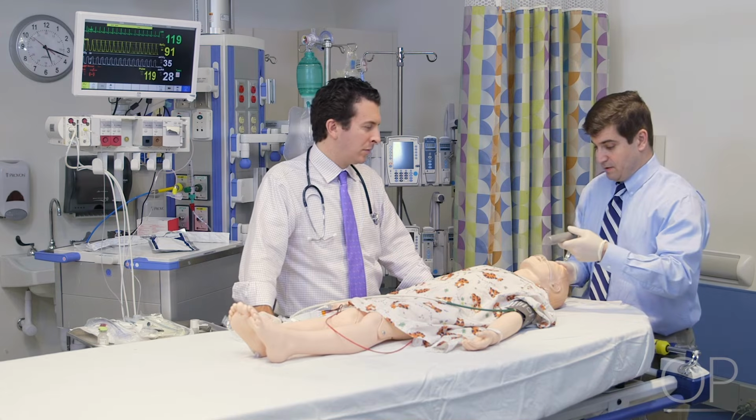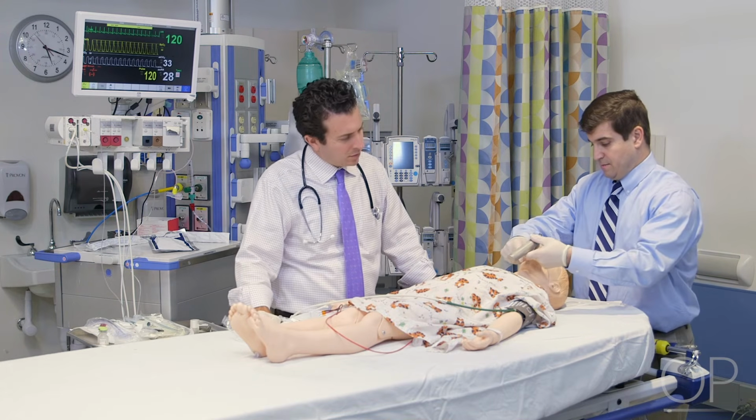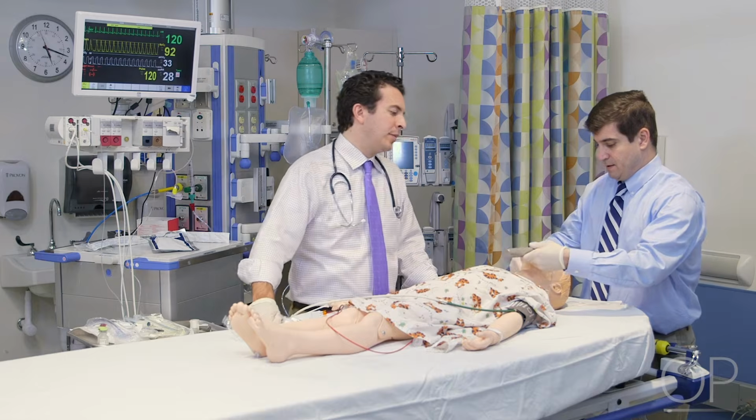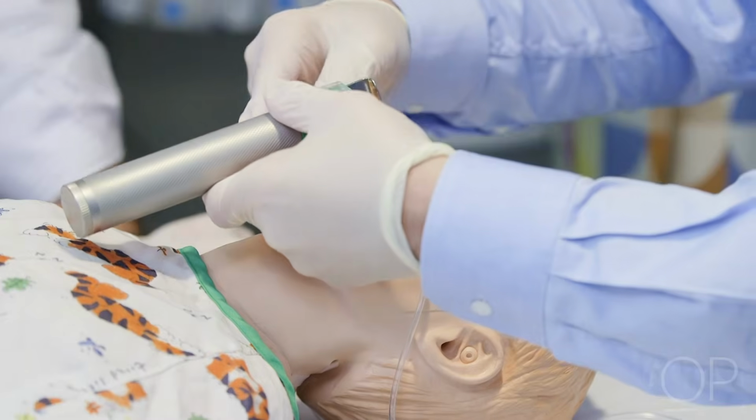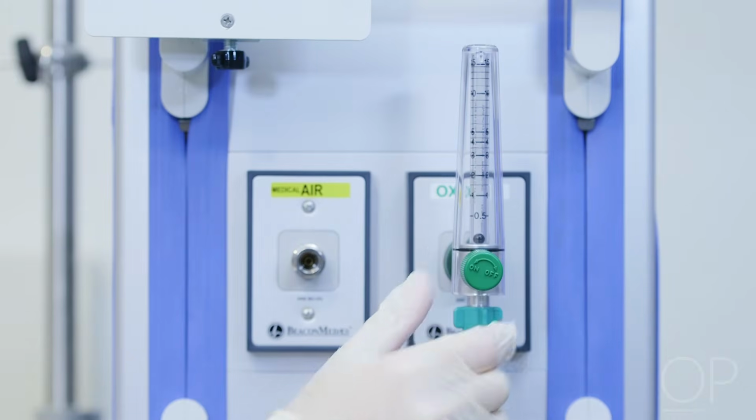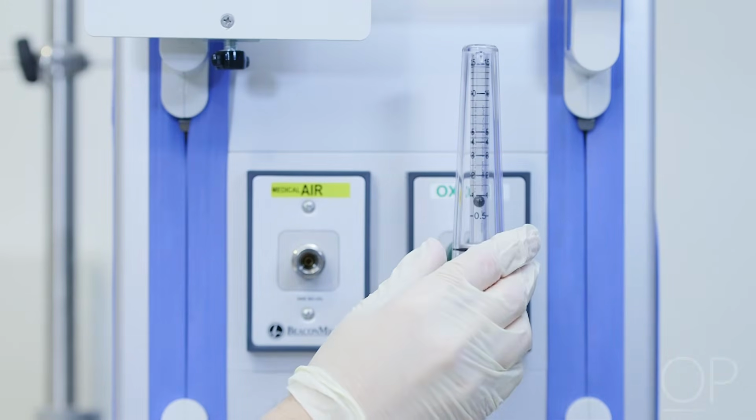The use of apneic oxygenation with continued delivery of oxygen by nasal cannula may decrease the risk of hypoxemia during laryngoscopic attempts. There are varied recommendations for flow rates during apneic oxygenation in pediatric patients.